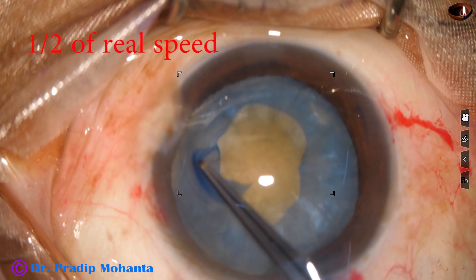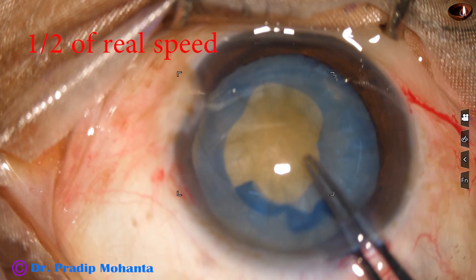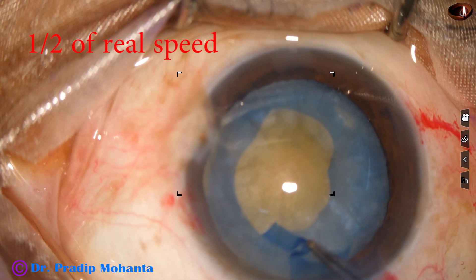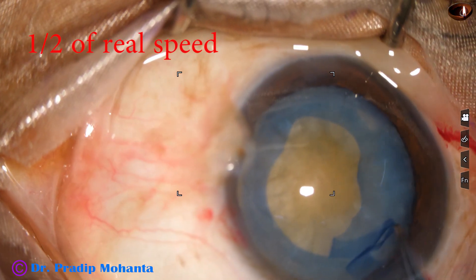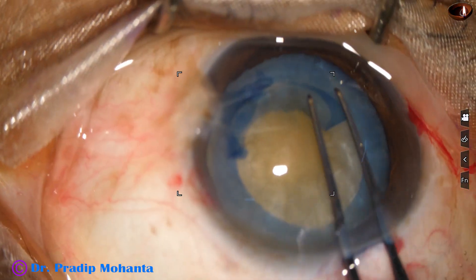Let us see this in slow motion — this is 50 percent speed. From 5 o'clock, gradually go to the periphery and casually complete the small rhexis.